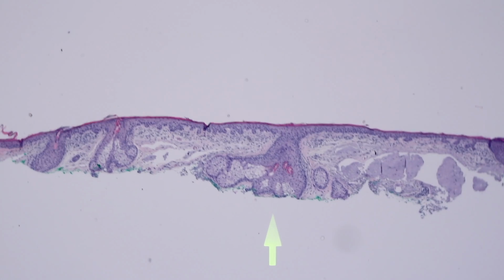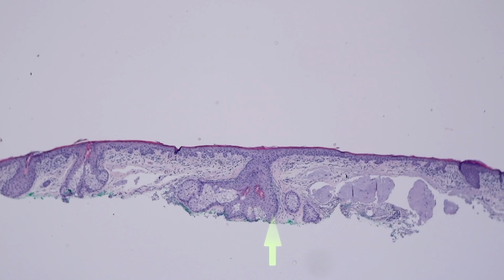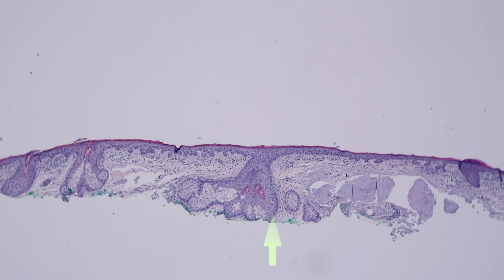All right, this one's kind of blue, and some of the color variation too depends on the H&E stain that your lab does. I've collected these from a variety of different labs, and sometimes the keratin is very bright pink, and sometimes not as much. Sometimes the keratinocytes are more blue, sometimes they're more pink. So it can actually vary.